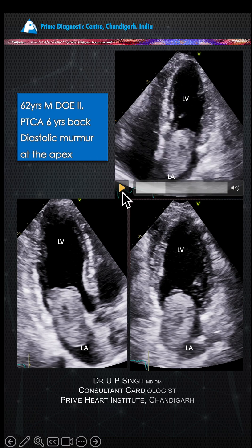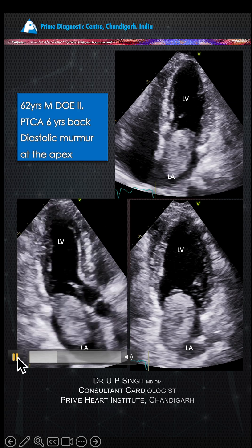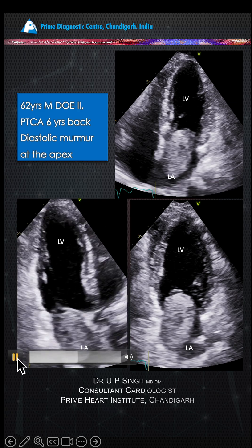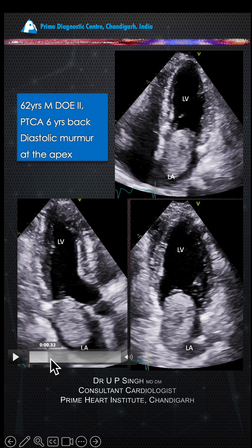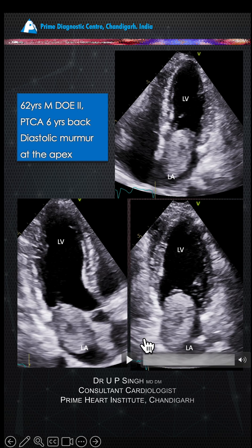There is a central lucency and this is attached to the inter-atrial septum. No rocket science — you guys know this is a left atrial myxoma. It's a mixed echogenicity with the central lucency and there is hardly any differential in this kind of situation.